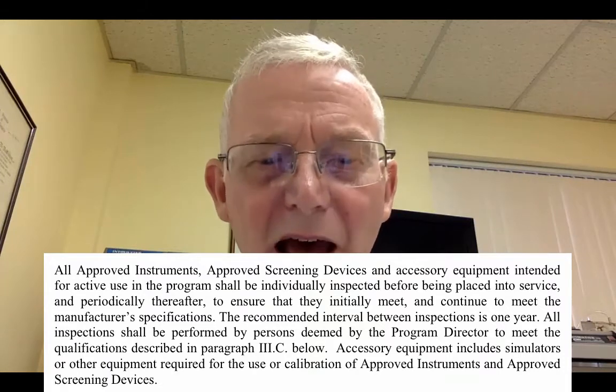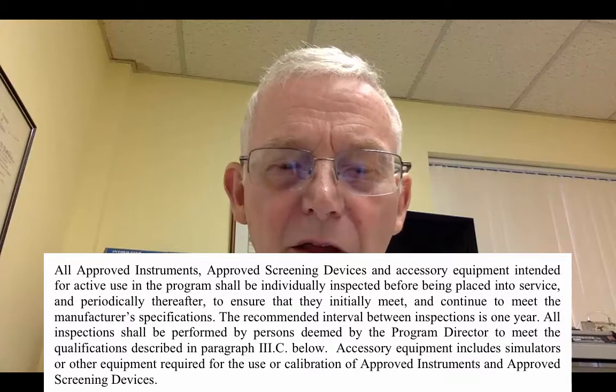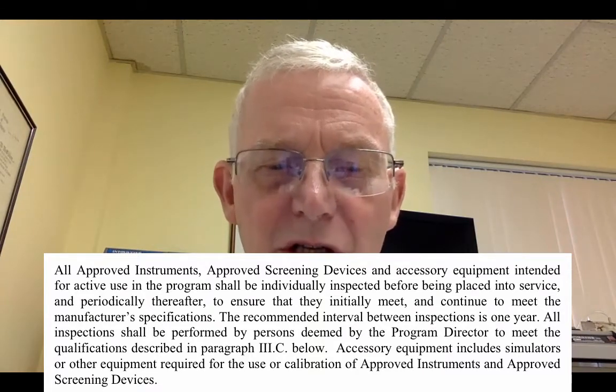Okay, and the purpose in doing that, Mr. Expert, is to make sure that they conform to manufacturer's specifications, and that's how we ultimately in court will know that they're calibrated at 50, at 100, at 150, at 300. Now, the Alcohol Test Committee and the Center for Forensic Sciences don't specify how the police or the Authorized Service Center conduct that inspection. Neither the Alcohol Test Committee nor the Center for Forensic Sciences nor any other state lab or provincial lab provides guidance to the police as to how they do that inspection. There's no specific standard operating procedure for the conducting of that inspection.